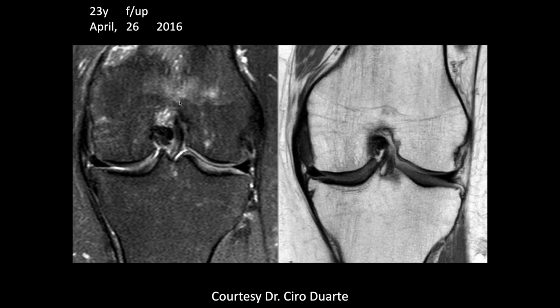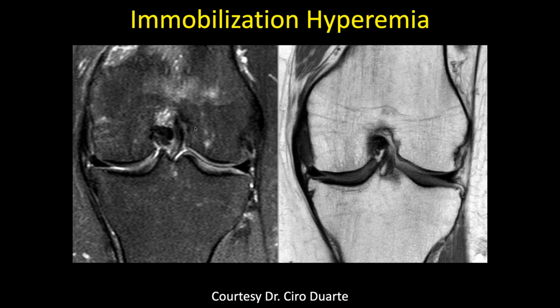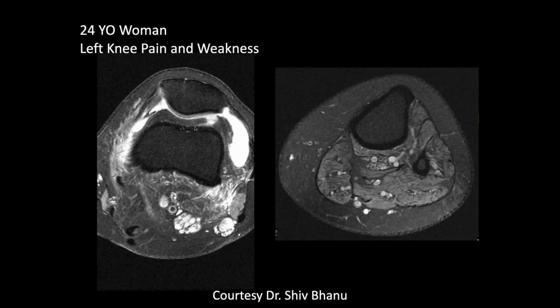So that's just an indication of disuse, osteoporosis, or due to immobility. So that's okay.